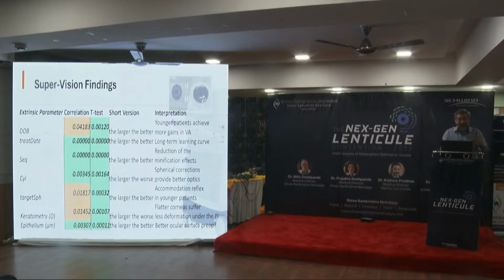So the treatment date, expect your first 100 patients to be different. You will not get the same result. You will think, oh, now after 40 patients I'm doing this, and then my results are still changing. Sometimes in one eye I'm getting a good result, the other I'm not. Something is happening. If you look at it after a year or so, you'll realize that you laugh at your own surgeries.